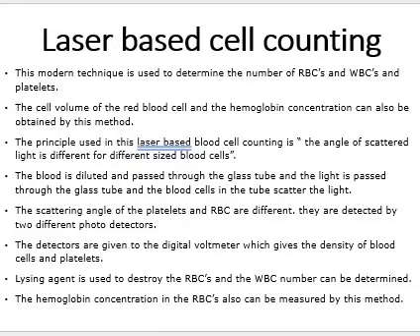If RBC is destroyed, the WBC will remain. The platelets have already been counted, so in the next iteration with the same solution, we get the WBC count.